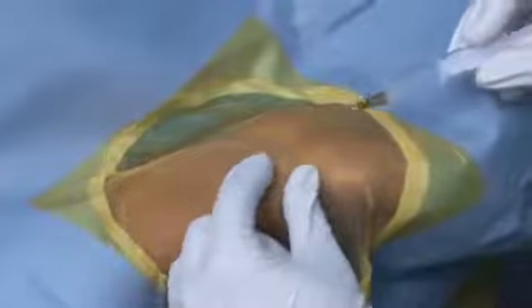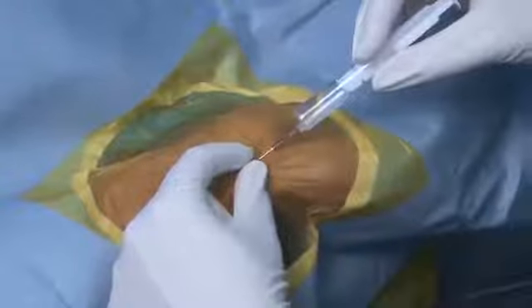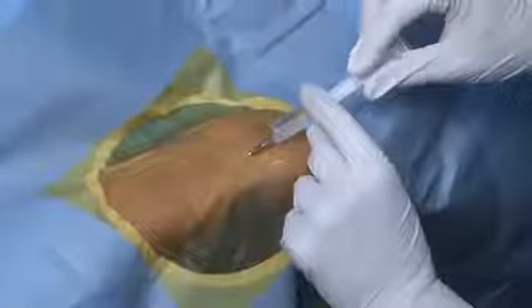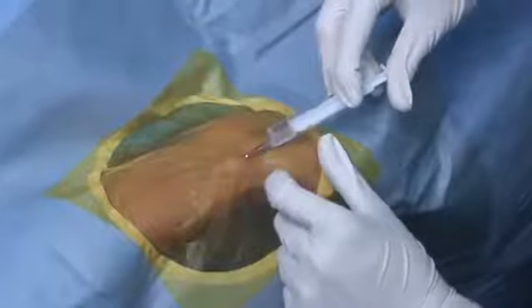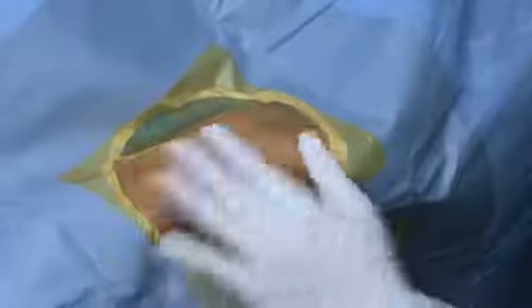This is local anesthesia being given — xylocaine with a 26 gauge needle. Unlike femoral, we are giving a very small dose, about 2 cc or at the most 2 and a half cc, because a higher dose can obliterate the radial pulse.